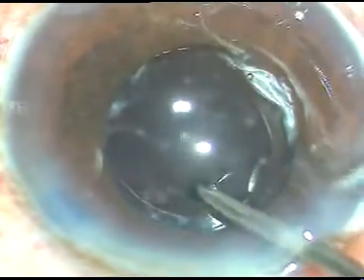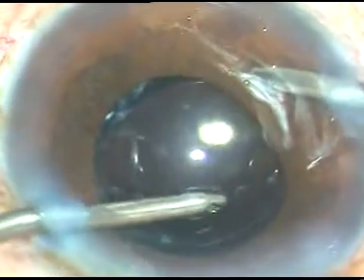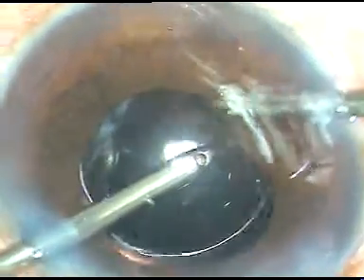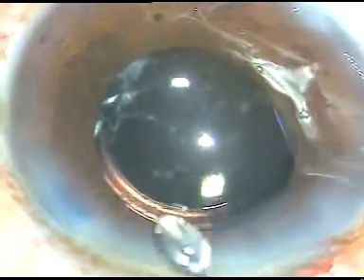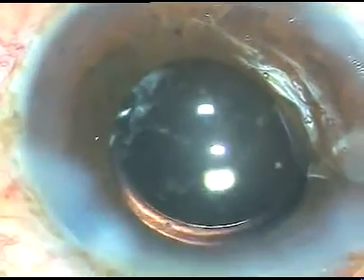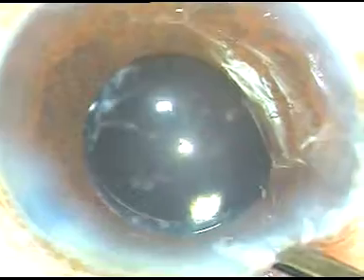The IOL is nicely placed with haptics in the bag. The viscoelastic substance is thoroughly cleaned out — first with the Simcoe and then with bimanual irrigation-aspiration. The viscoelastic substance should be cleaned out nicely to avoid post-operative rise of intraocular pressure. The side ports are hydrated, a final BSS wash is given, the anterior chamber is formed, and the case is complete.